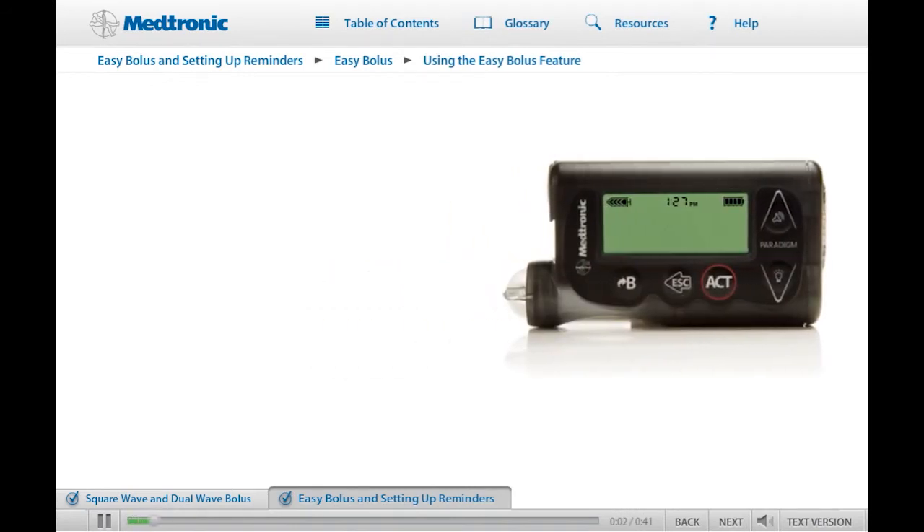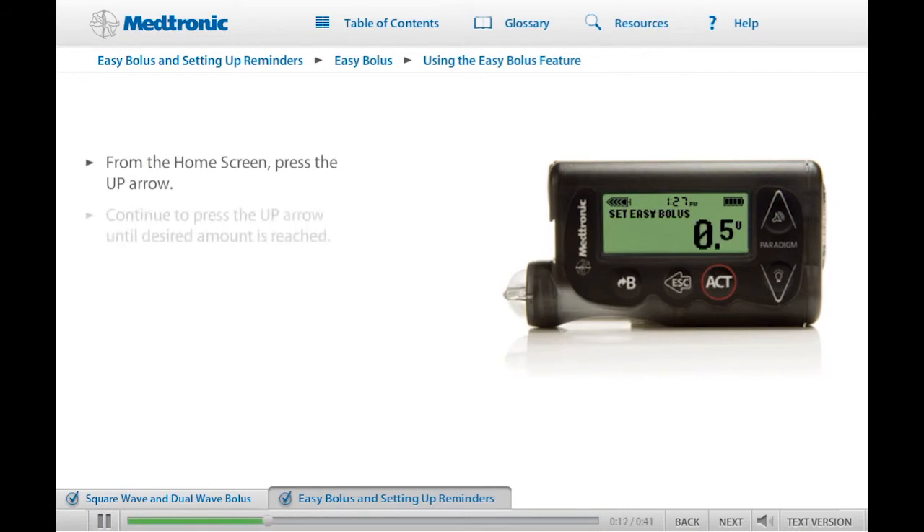To use the Easy Bolus function, go to the Home screen and press the Up arrow button. The Set Easy Bolus screen will appear and the Step value will be flashing. Press the Up arrow button. The bolus amount will increase in steps until the desired bolus amount is reached. Then press Act.